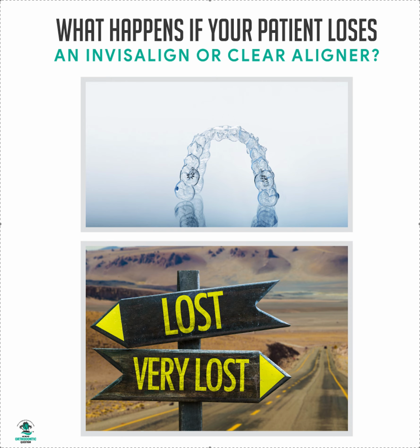If you did decide to order a replacement aligner number 20, and then after you deliver that, it doesn't fit that well, and you're like, shoot, now I want to do a refinement, well, you can order a refinement then, too. But keep in mind, you can't do two things at one time. So if it's currently producing a lost aligner, which takes a few days in shipping, the portal is going to be locked. So you will not be able to go in and do an actual refinement on that patient. So you can only do one action at a time. So always get the lost aligner first, especially like what if you lost an aligner on the lower, but the top's fine? Well, you're going to keep going on the top, but what if you want to start a refinement instead? So that's all these things you need to keep in mind.